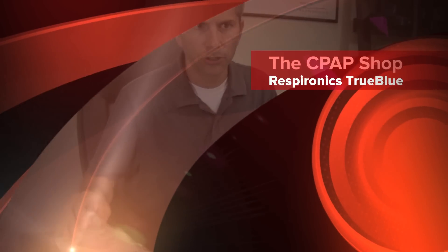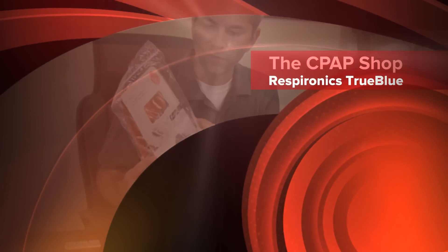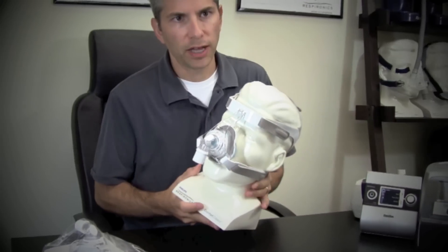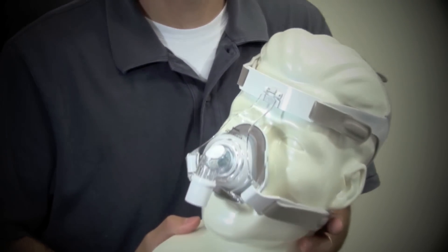Hi, this is Chris from The CPAP Shop. I wanted to show you the new Respironics True Blue Nasal Mask. This mask comes fully assembled. Here it is. It's available in five sizes: petite, small, medium, wide, and large.